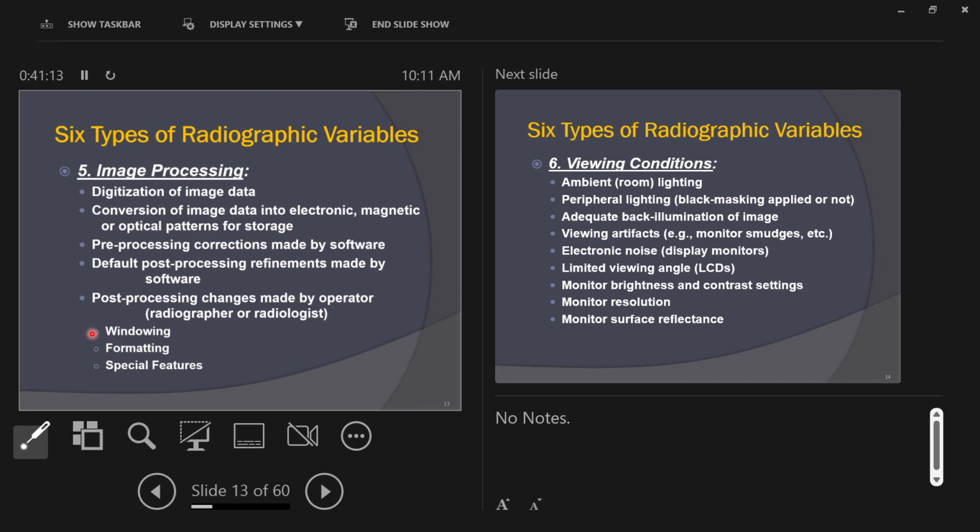Yeah, the program that's used where I'm working has a brightness and contrast tool. Not before the exposure, right? You're talking about the image you have on the screen? Yeah. Once you take the image of the patient, even the doctors have access to that tool, but it doesn't change the original. That's really good. In some cases with newer software, you save the original image data, and when you bring up the image, you make temporary changes to it, soft copy changes to the image, and then they aren't saved.